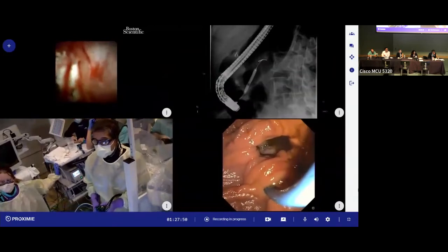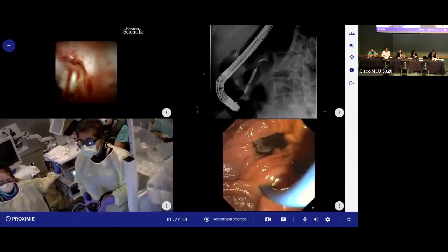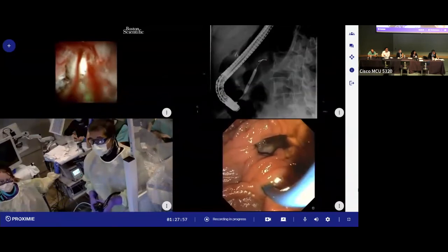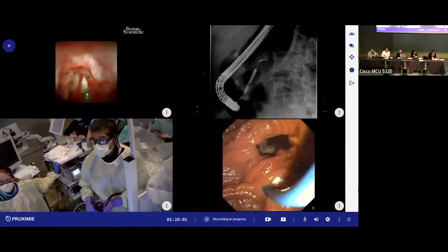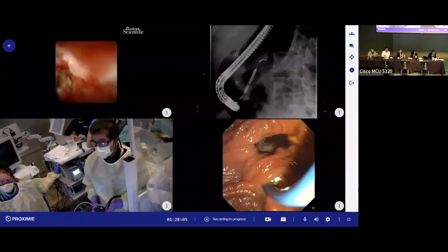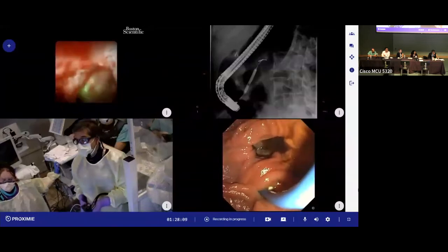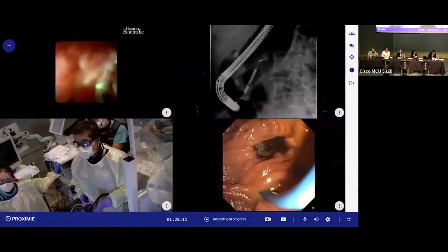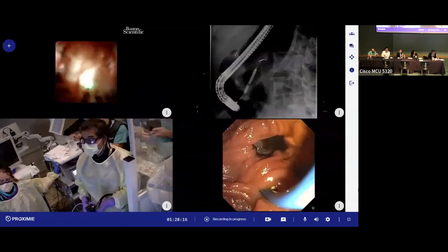We've been doing this for a few years, and I have learned that we don't want to do too much cautery. The pancreatic duct doesn't like cautery. It's not so much for pancreatitis flare-up, but I've seen a couple of cases where the stricture actually gets worse after laser. For the most part, we use it to treat the stricture, but if you do too much cautery, it becomes much more difficult. Now we can target the stone better. Irrigate here, and we're on stone busting.